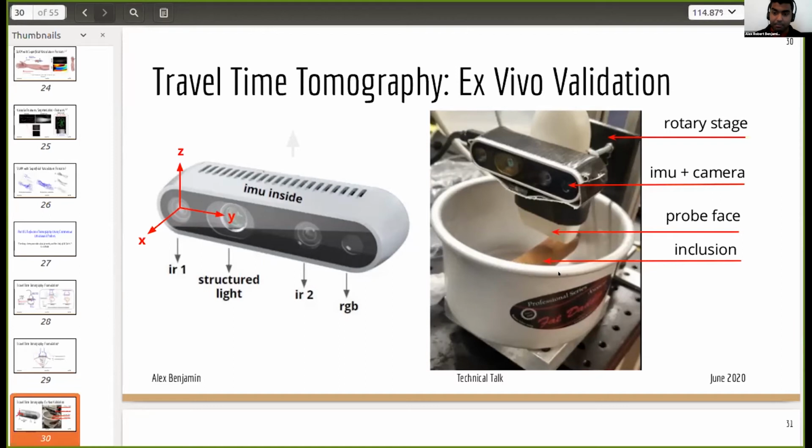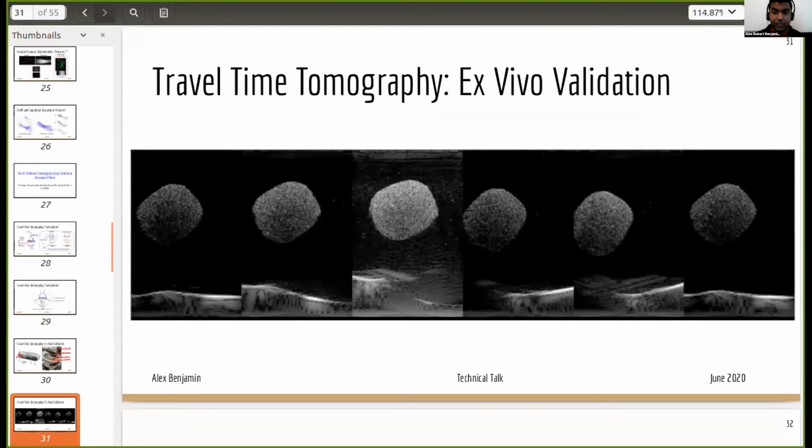And currently the paper that's in the works, and we're hoping to submit this soon, basically showed that instead of looking at it once from a single point of view, which is image number 3 on this slide, if you look at it 7 times from 7 different viewpoints or vantage points, you get a lot more constraints on your inverse problem, which allows you to much better estimate the underlying slowness map.